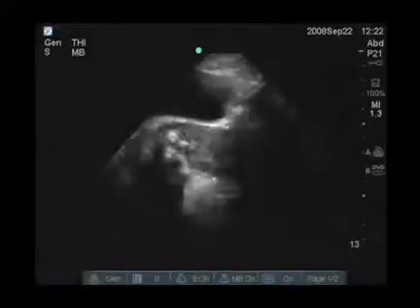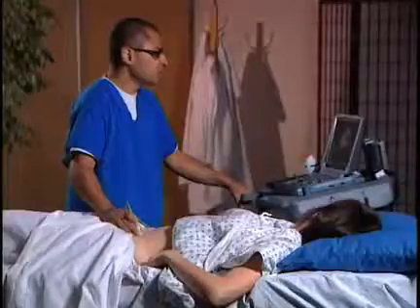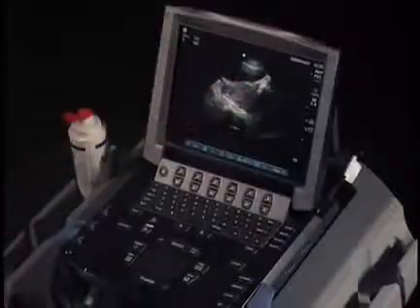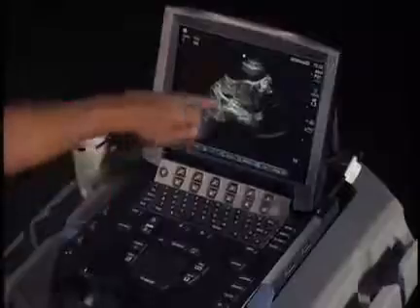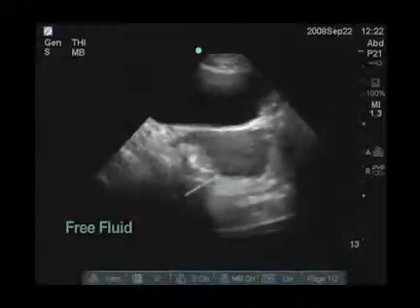And in between, we're also going to identify the uterus. So we're going right to the very top of the bladder, to about mid-bladder. We can see the uterus here in the center. A very small amount of free fluid here, which can be physiological as well.